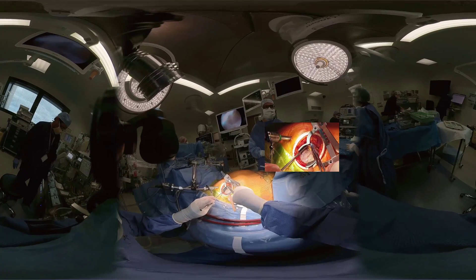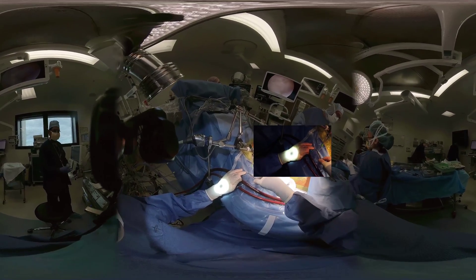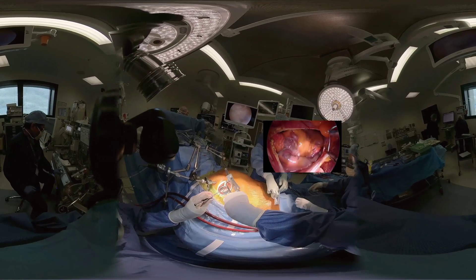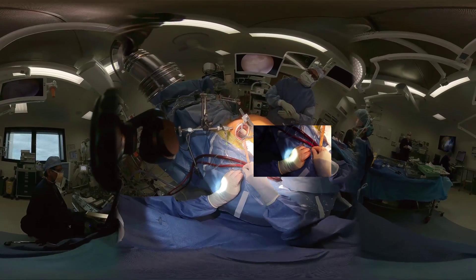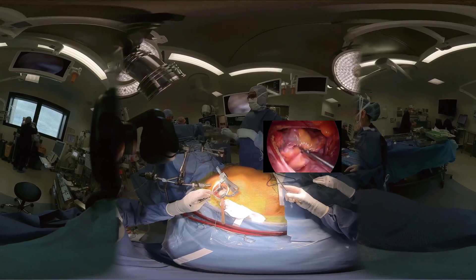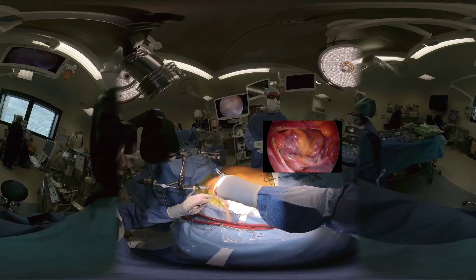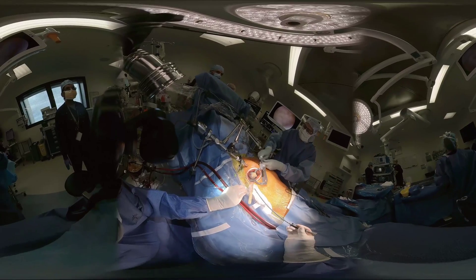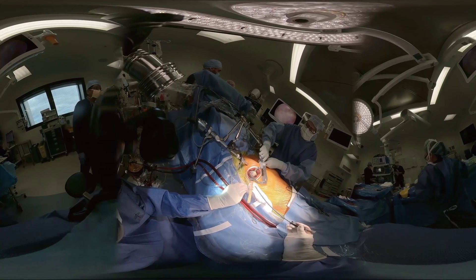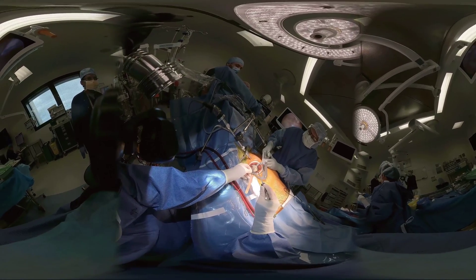Three suture retractors are placed to expose the left atrium. Two sutures are placed in the posterior pericardial tissue and the third suture is placed in the interatrial groove. This third retracting suture is exteriorized through a 5 mm anterior chest port just lateral to the border of the sternum. This port is carefully created so as not to injure the internal thoracic vessels.